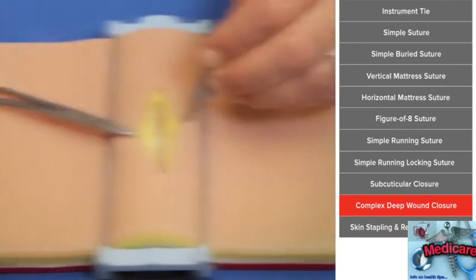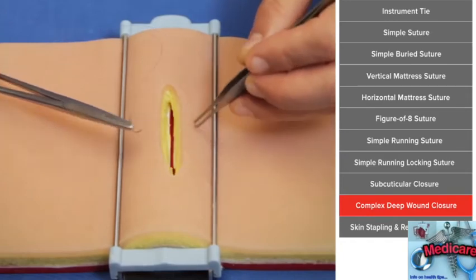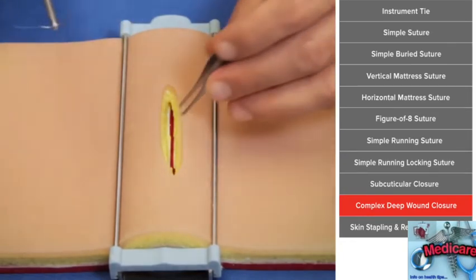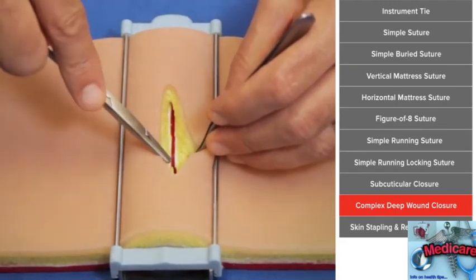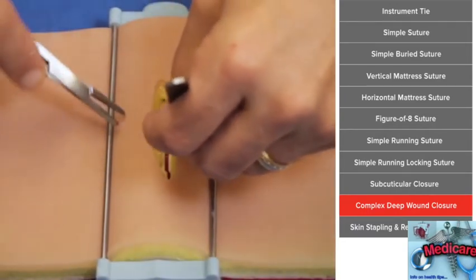So if we just close the skin here, there almost would be this potential space underneath where fluid could collect, or the skin would have so much tension on it, it ultimately would pull apart. This is especially true over joints, where you're bending the arm or bending the knee, and you might pull things apart. So what we'll do here is we'll first close the fascia.